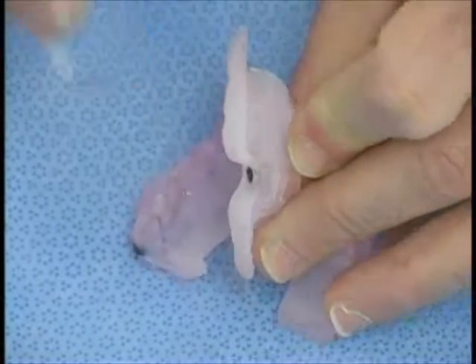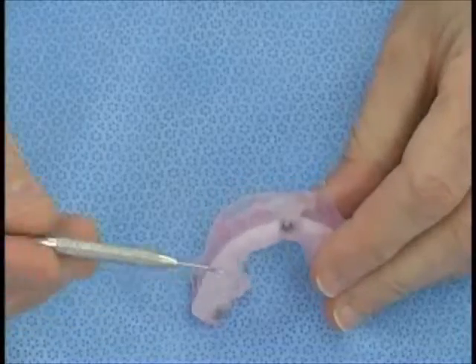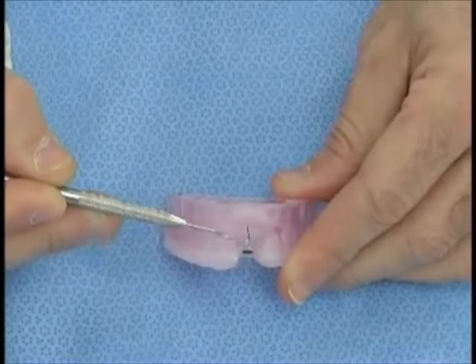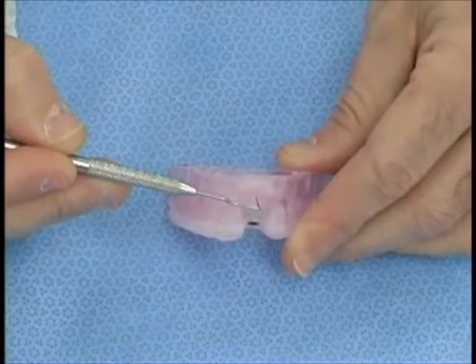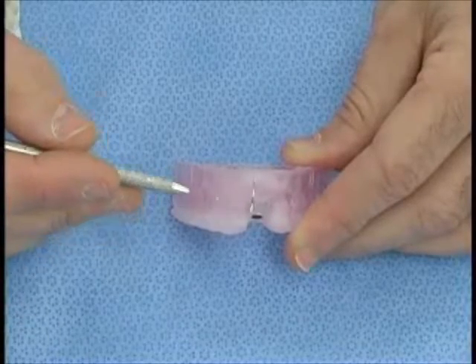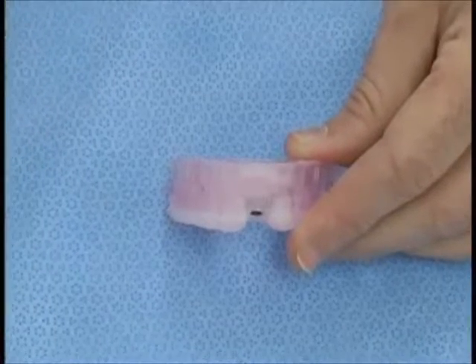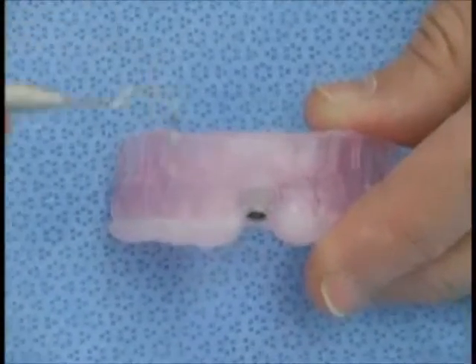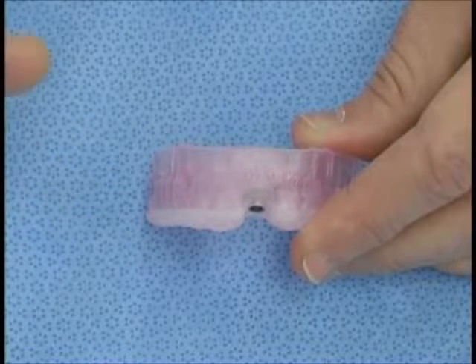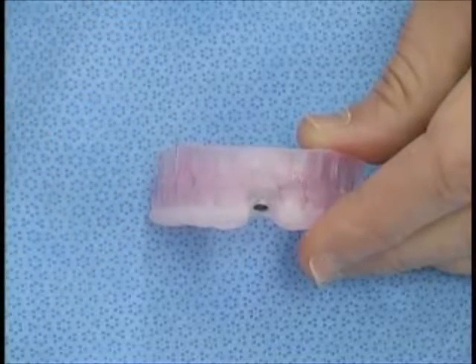When you start to put the dimensions together on the model, if you want to place a 13 millimeter implant, you have to factor in the 5 millimeters of the tube. Probably it's about a millimeter above the gingival margin on the buccal, and you want to place the implant either 2 or 3 millimeters below, plus the 13 millimeters of the implant. So these numbers and this kind of formulation is very important to know ahead of time. In this particular case, we're going to do 13 millimeters for the implant, 3 millimeters for the transgingival component, and 5 millimeters for the tube. It basically comes out to about 21 millimeters.